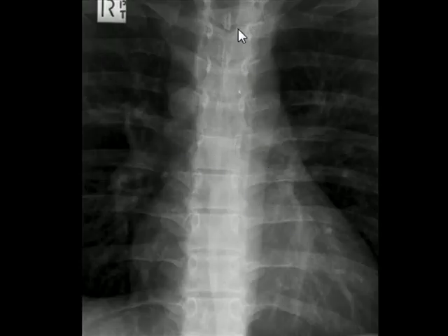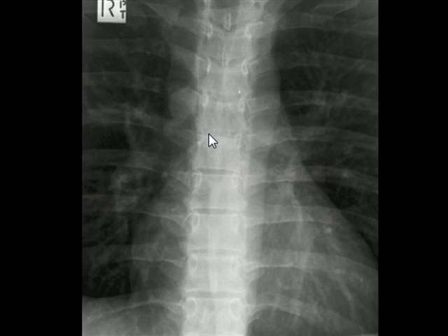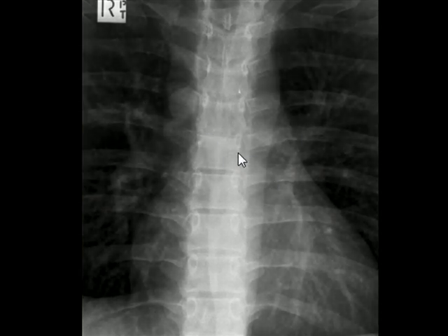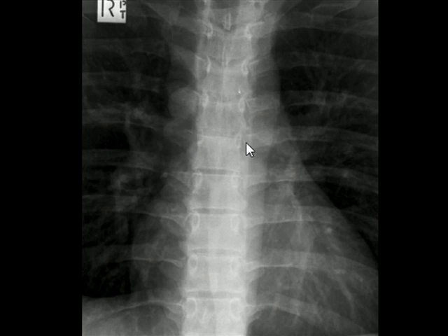This is the supine X-ray of the same person. Notice the size of the azygous vein, which is artificially enlarged in this supine projection. Because the exposure is set for the thoracic spine, the thoracic vertebrae are clearly visible. The carina and right and left main bronchi are also clearly visible and appear much better compared to the PA view.